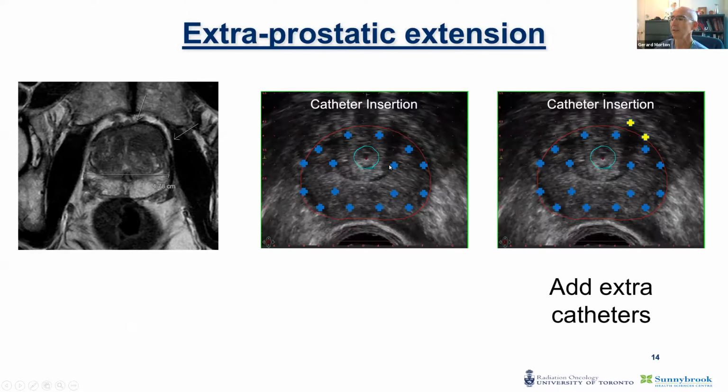Standard 16 catheters may be challenging because in order to push dose here, we're going to have to increase dwell times in these catheters that are quite close to the urethra. So it's going to be difficult to achieve this.